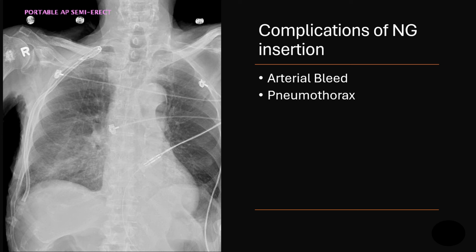NG tube insertion, or nasogastric tube insertion, is a procedure we do frequently. In addition to nursing, doctors do this procedure as well. It basically does two things. One, we usually use it in bowel decompression, so in the setting of a small bowel obstruction, for example, or we may use it as an alternative form of nutrition, among other indications. So I'm just going to group in NG tube, Dobhoff, OG, all these things, okay?